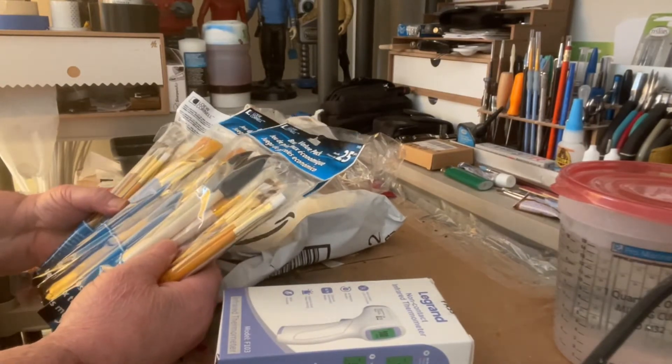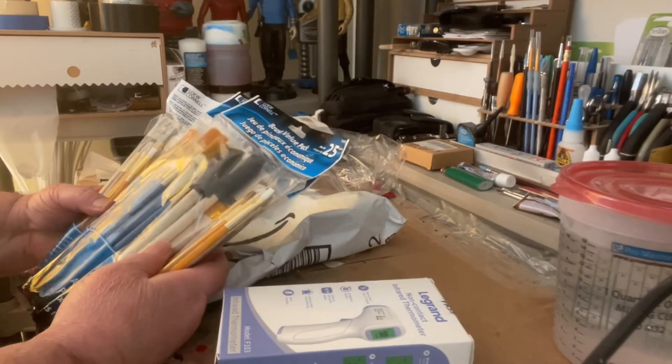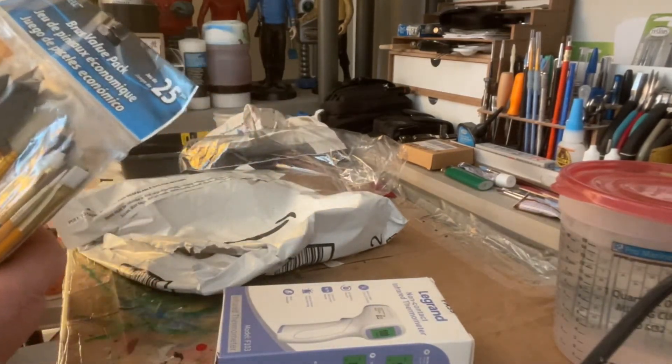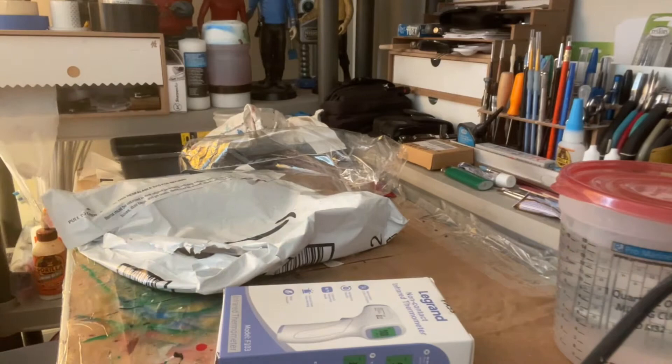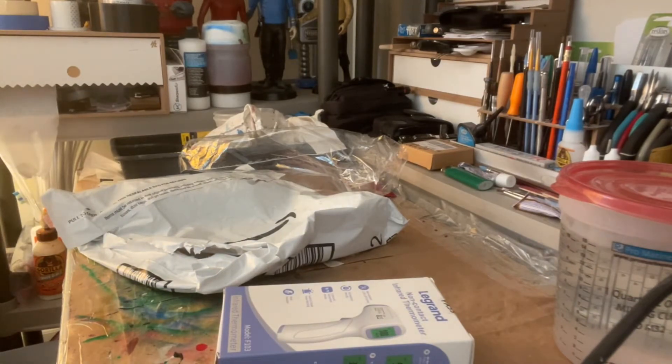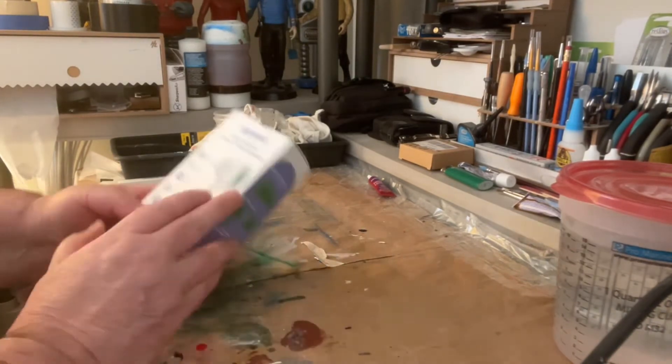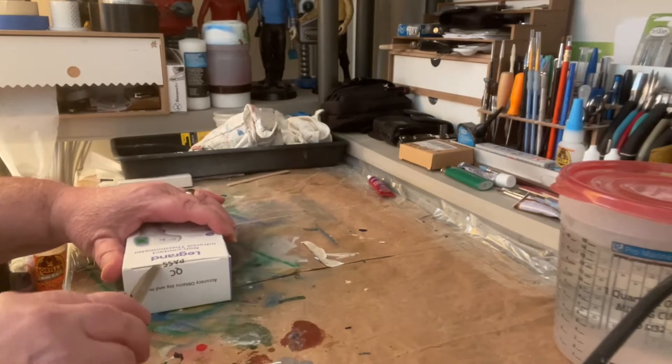I only ordered three, so I'm going to have to give one to a friend of mine — I know who I can give that to. Let's open up this thermal thermometer. Hopefully this works.